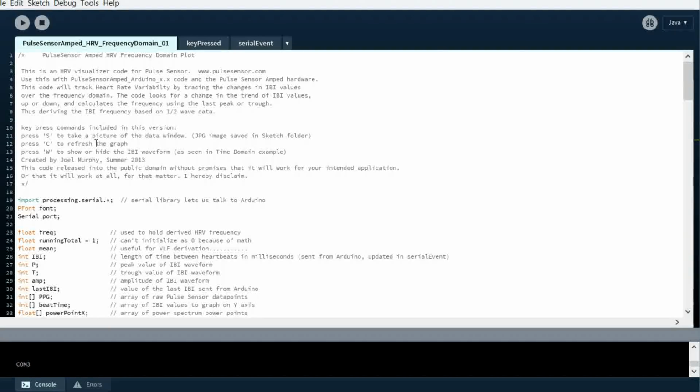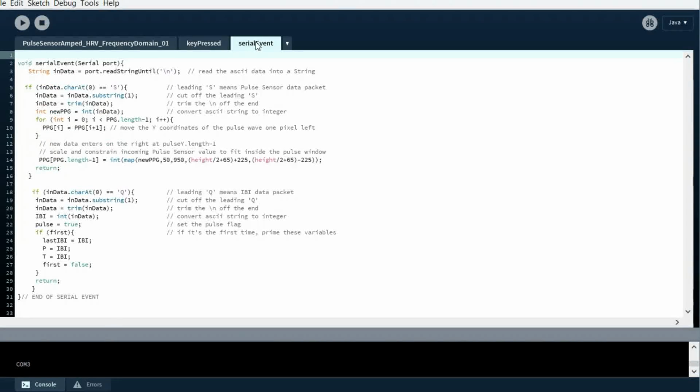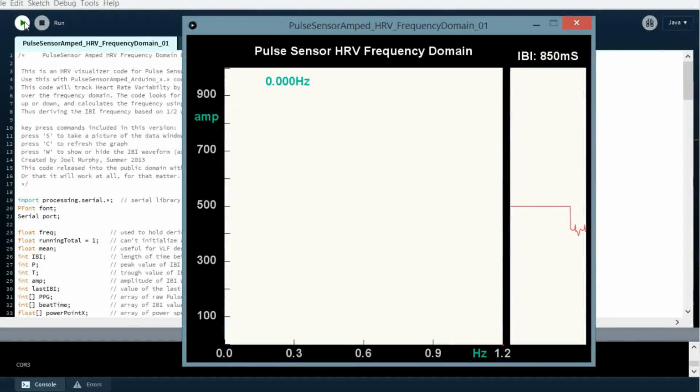So it's got this key pressed event page, which for me does not work at all, and then the serial event, and you guys can go over that stuff on your own. I'm not going to go over it too much because I'll provide a link to download it, but it's not my code. Anyways, I will show you it here in operation.